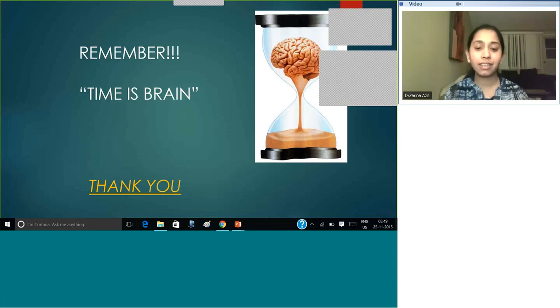So if the residents make a mistake in 1 or 2 points of the score, it is fine. But grossly, we at least give the broad category. The residents are trained to read this ASPECT scoring. So it's more about getting trained. I don't believe it delays at all. ASPECT scoring is a very, very helpful tool for us to go ahead and plan the endovascular treatment. So I think it doesn't delay at all.